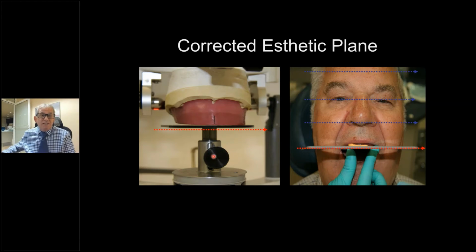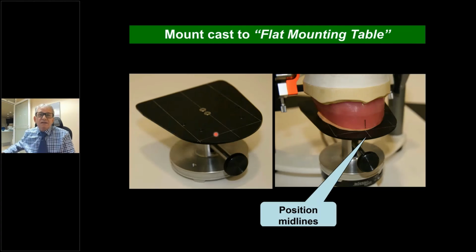The real nice thing about this, Kelley Lab has to just drop this. These have millimeters on them. We drop it 1 millimeter. And what's really nice, when I go back, I already know where your midline is. I already know where the labial was, even though I moved this. If I don't have this, then I have to bring the tooth down, and then I've got to try to use my hand to hold another tooth, and I pull that one down.